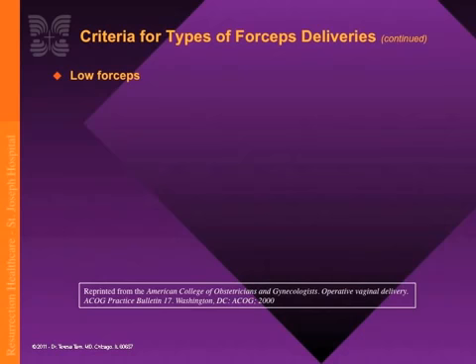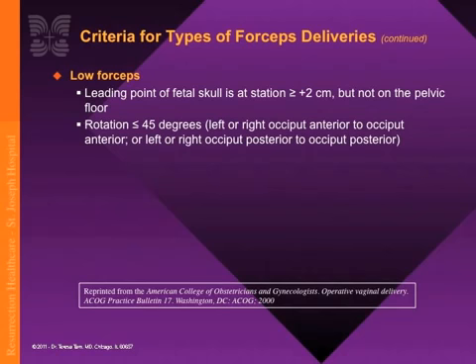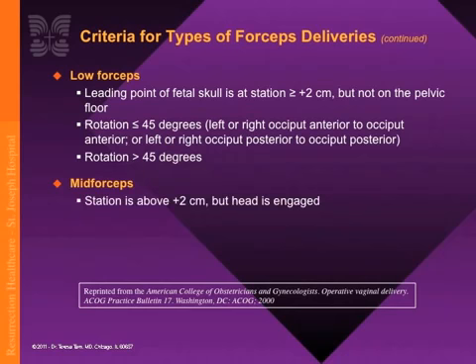Forceps delivery is considered low forceps when the leading point of the fetal skull is at station greater than or equal to 2 centimeters but not on the pelvic floor. Forceps rotation of less than or equal to 45 degrees, or if the rotation is greater than 45 degrees. Mid-forceps is when forceps application is performed above +2 centimeters station but the head is engaged. High forceps is no longer included in the classification because it has been abandoned in favor of a cesarean delivery.